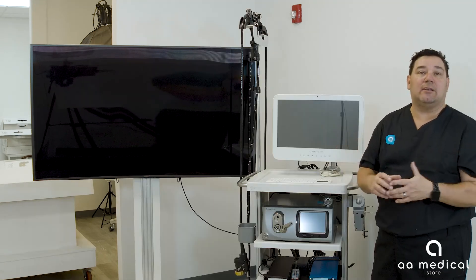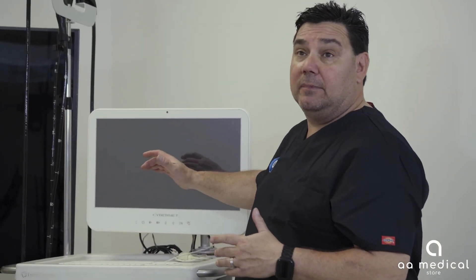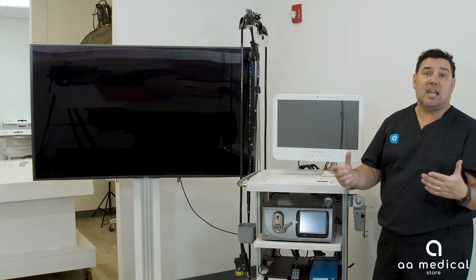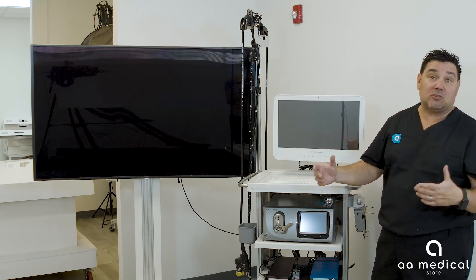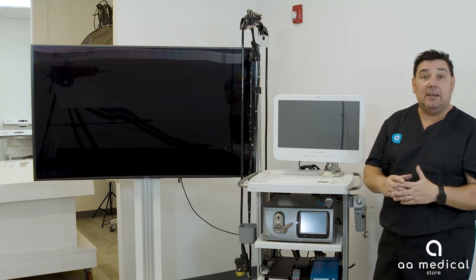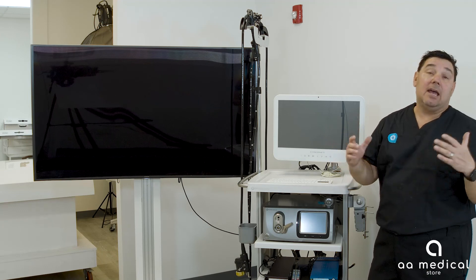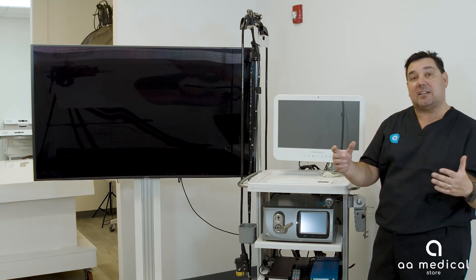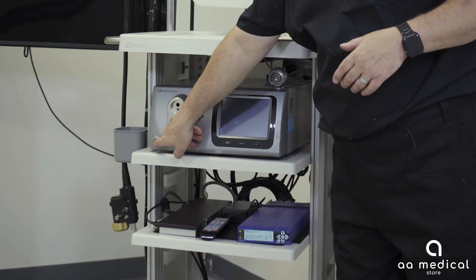We'll turn the system on and walk through the features and benefits. This is the actual EndoChoice Fuse full spectrum endoscopy system. There are a couple of working components: the top is your computer or drive for the system, which stores patient information and captured images from the scope. Then you have the actual Fuse box which runs the scope. For this demonstration we've used a 65-inch 4K LED TV to see all three images on one screen, though you can also hook up three separate monitors.